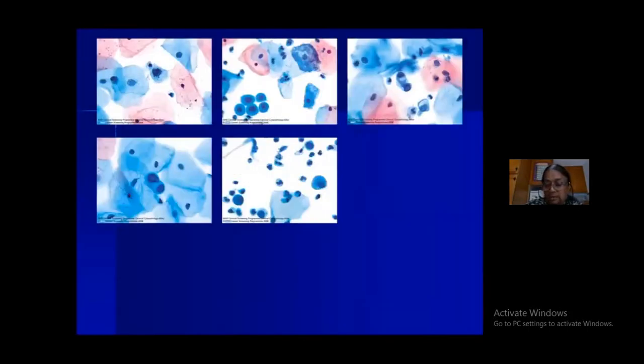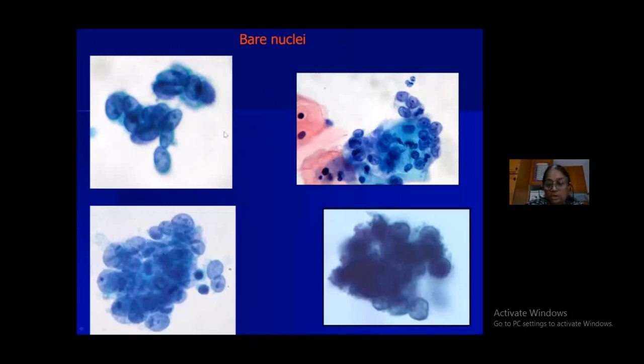Cells with dark nuclei. Dark nuclei may be due to degeneration, but HSIL and ASC-H can also give those types of small cells, while degenerate endometrial cells are the other condition where small cells are present. Bare nuclei can be negative, with no chromatin abnormality, in atrophy and endocervical cells, while HSIL has chromatin abnormality, so abnormal. Tamoxifen therapy in breast cancer also gives a lot of bare nuclei.